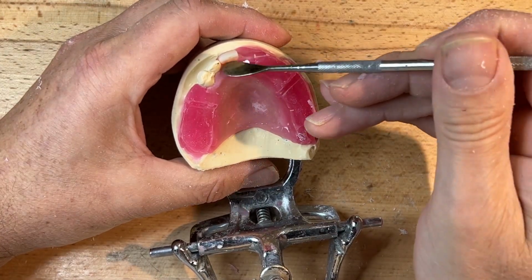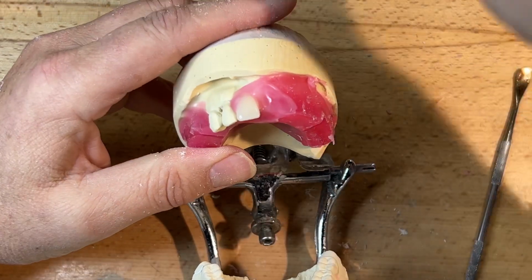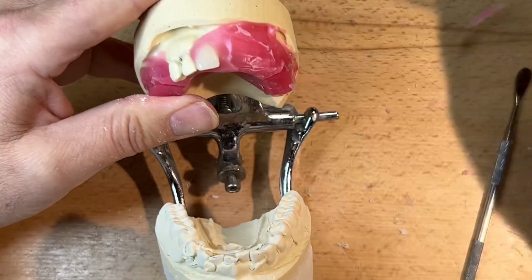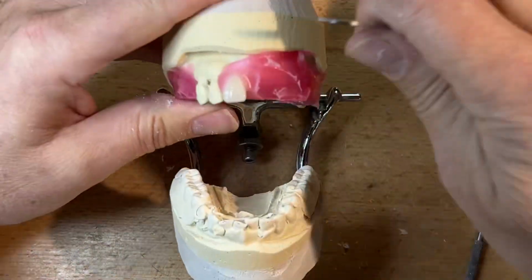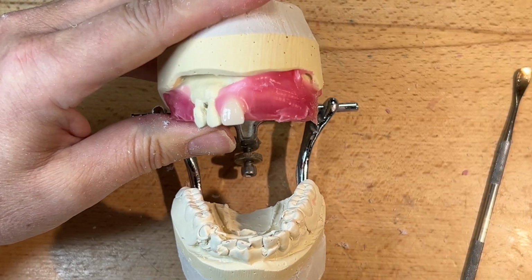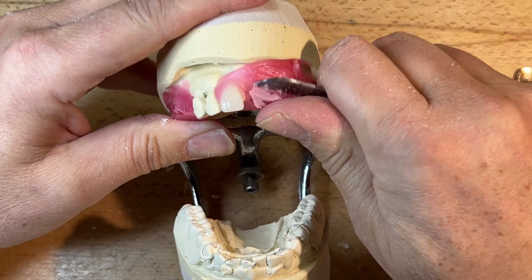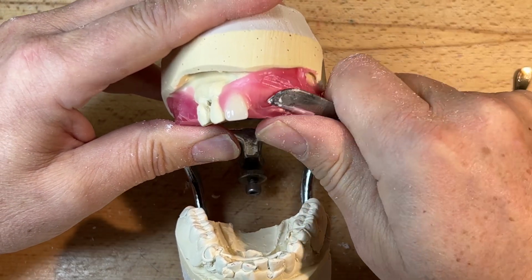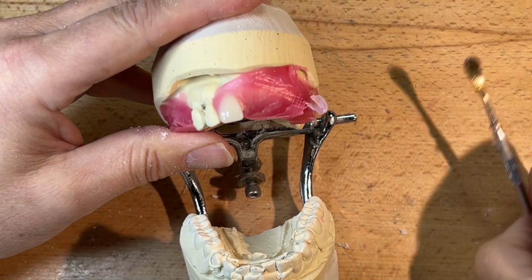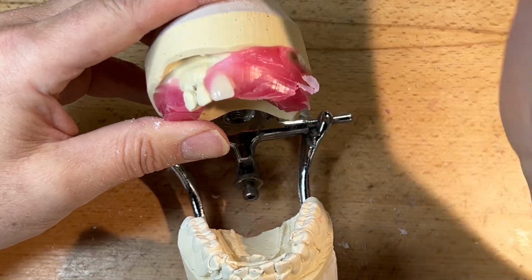a little ala-tragus line. So we're going to move on to the next one, and I'll try to expedite this. Now, I've taken the midline off the occlusion rim, but I have it marked here on the lower. And in this case, very simple, it does match up with the lower. Many times it doesn't. We've got teeth drifting on the lower with some edentulism that may have occurred. And again, I have created this occlusion rim with no base plate in the anterior flange. We don't need base plate there.